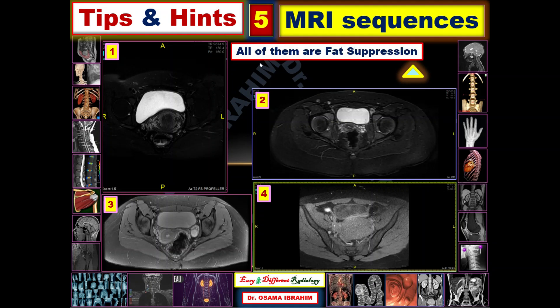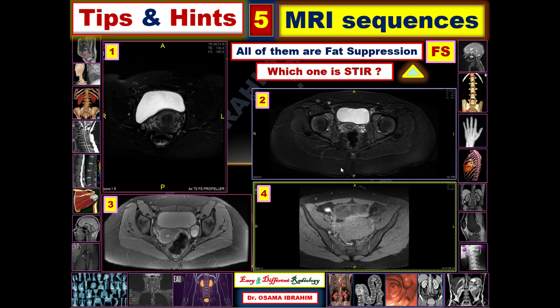As usual, I start my presentations with a question. Today's question: all of these four images are fat suppression sequences, referred to by FS, meaning fat suppression MRI sequences. However, all of them are different MRI sequences. Which one of them is the STIR image?